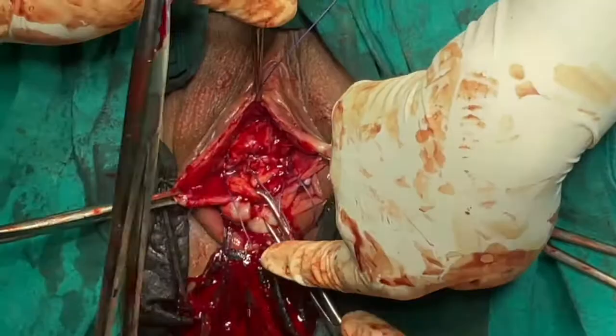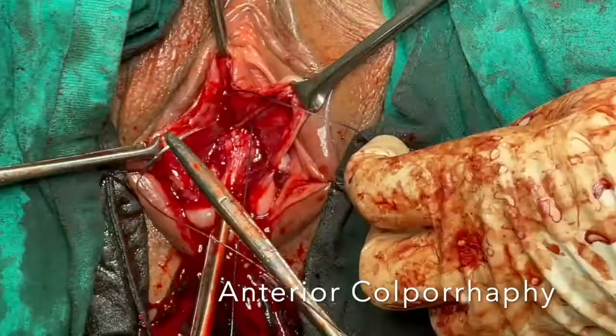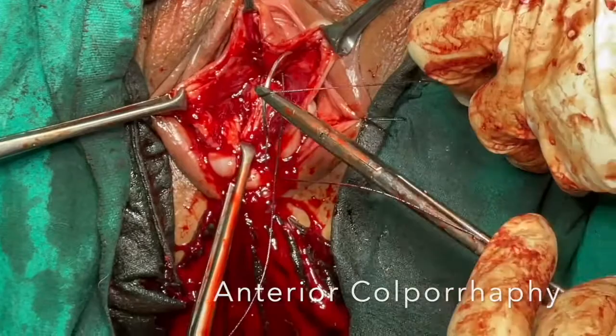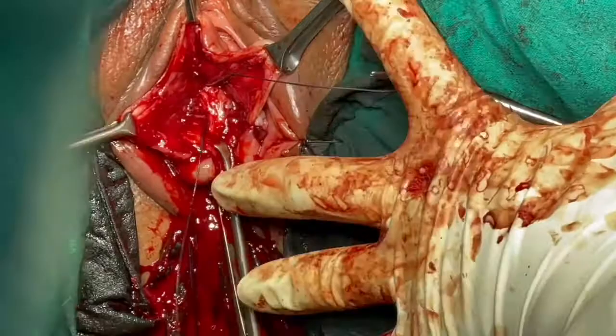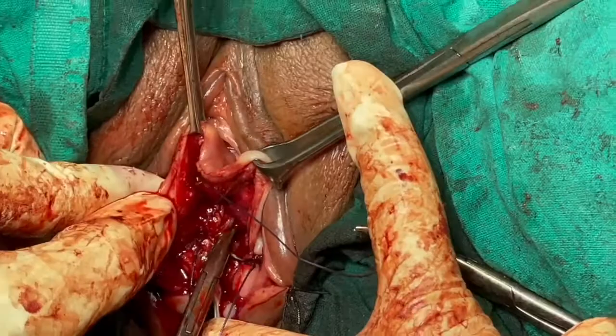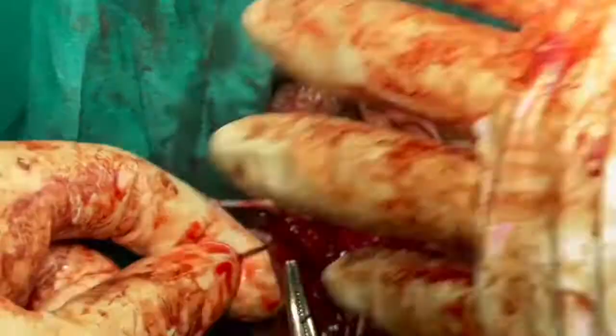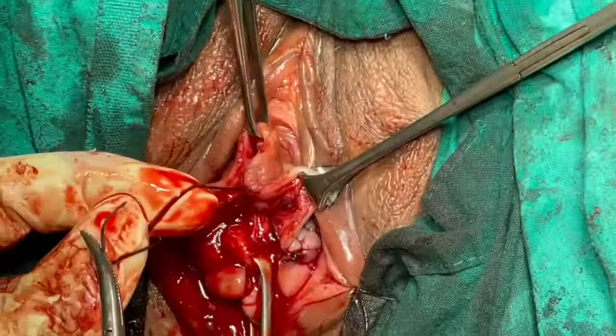Once both side procedures are done, you proceed with anterior colporrhaphy. Anterior colporrhaphy can be accomplished either by plicating with a series of sutures in the midline taking bites through the right and left pubovesicocervical ligament, or you can take simple purse-string sutures. In this case, the needle has passed through the paravaginal tissue and through the divaricated pubovesicocervical ligament on the left side, through the anterior cervix, and through the right paravaginal tissue so that the pubovesicocervical ligament is reconstructed. The gap is closed off, pushing the bladder high up into the abdomen, thereby preventing recurrence of the cystocele.